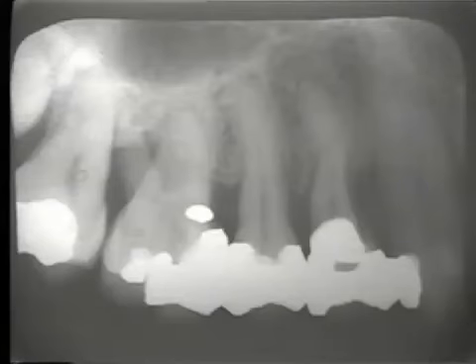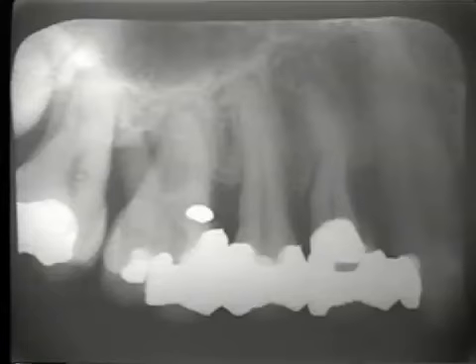Next, we radiograph the maxillary right bicuspids and first molar. We endeavor to open the contact between the first bicuspid and the cuspid. This would afford us a view of the distal side of the cuspid, which we may have missed on the previous radiograph. In this illustration, he has metallic fillings, and so it matters little whether this contact is opened properly or not. We're using a new size film, the number 2 size film.